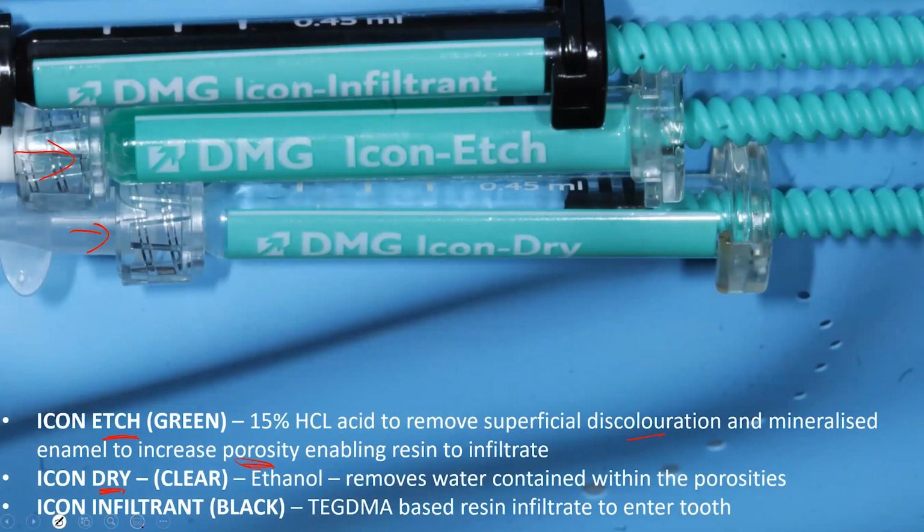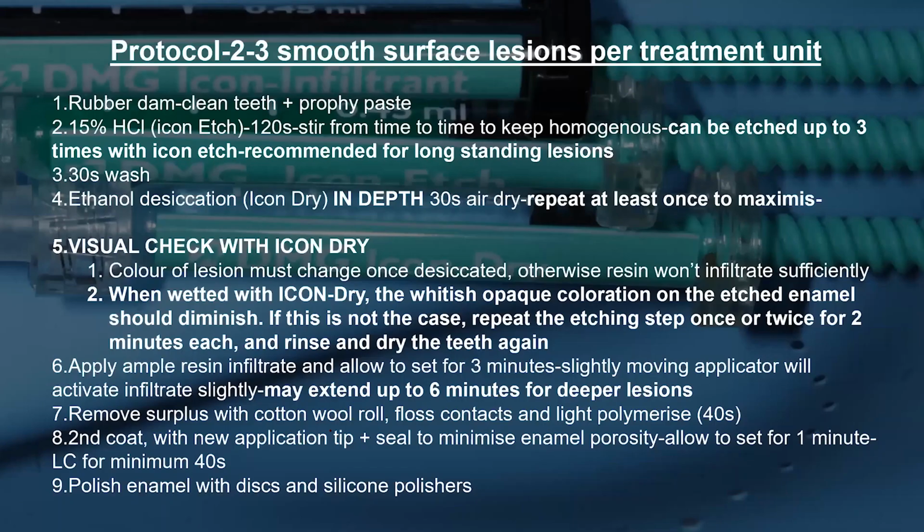Then you have the Icon Infiltrant, and this is here in the black syringe here. And this is the TEG-DMA based resin infiltrant that will enter the tooth and has a similar sort of refractive index to enamel. So this protocol I put here is essentially just from the instructions.